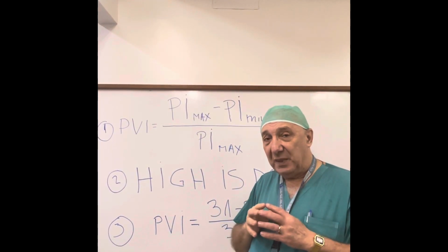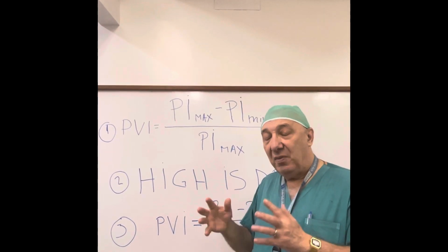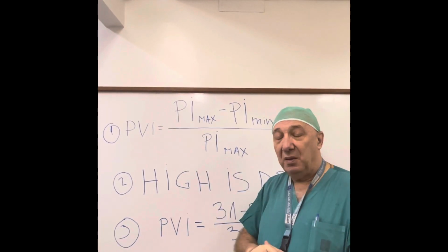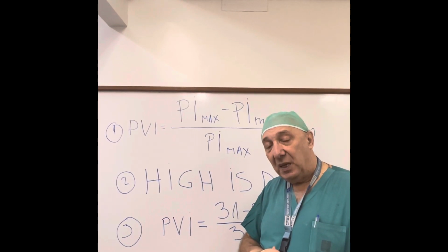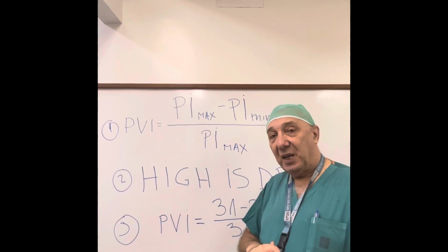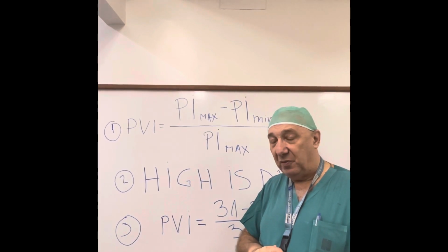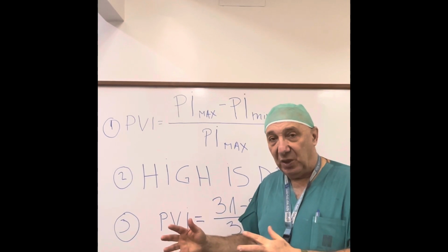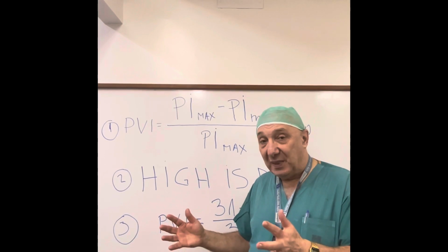It is a very complex relationship between what happens in the intrathoracic cavity and the cardiovascular system. Basically, this number gives us an indication of the volume status of the patient, basically the preload. The patient of today had a very high pneumoperitoneum and a certain degree of Trendelenburg. So on one side the pressure was diminishing the venous return, on the other side the slight Trendelenburg compensated somehow.